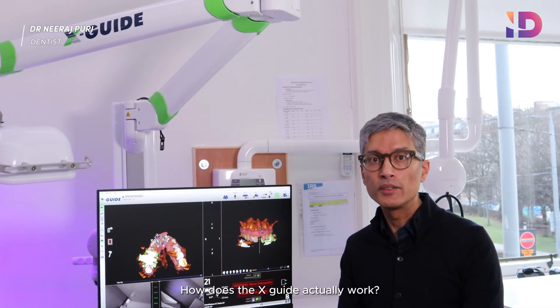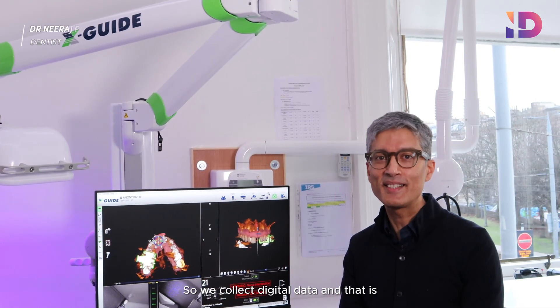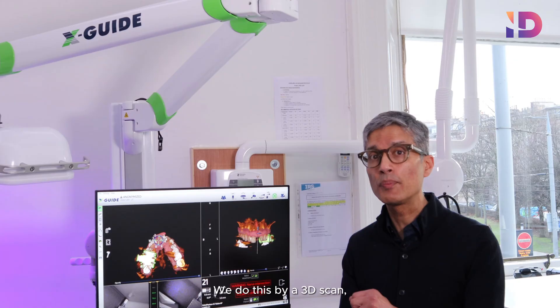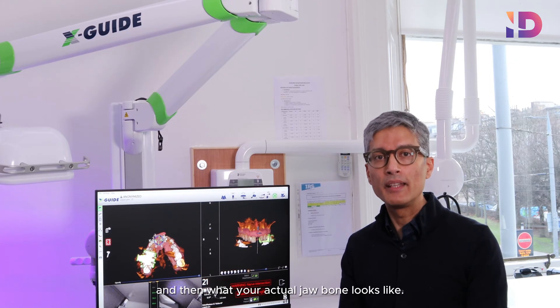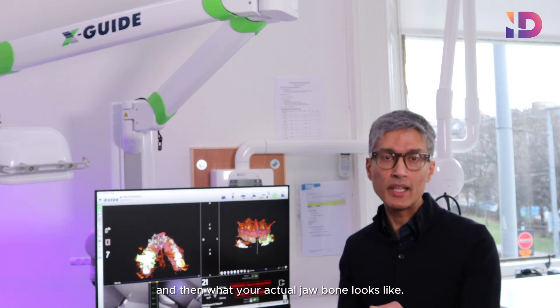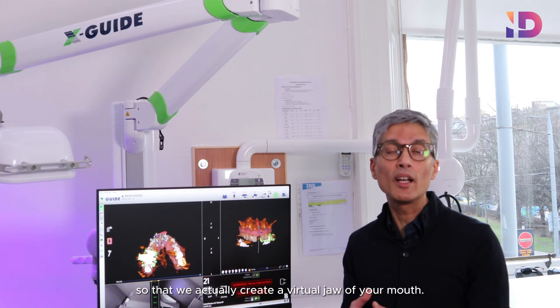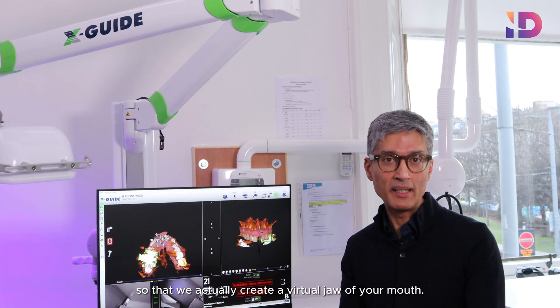How does the XGuide actually work? We collect digital data — what your teeth actually look like — by doing a 3D scan, and then what your actual jawbone looks like, which we do with a 3D CT scan. We marry those together so that we actually create a virtual jaw of your mouth.